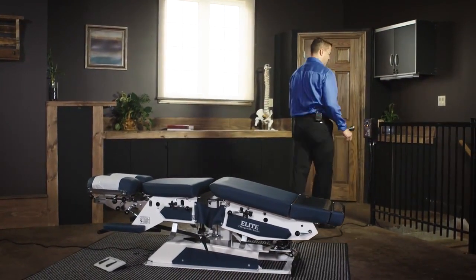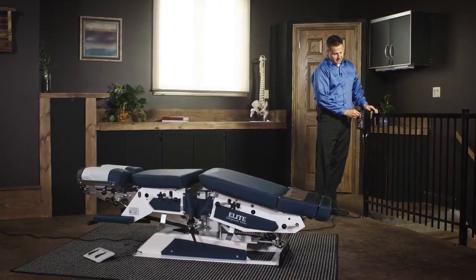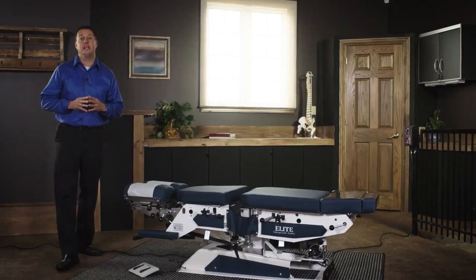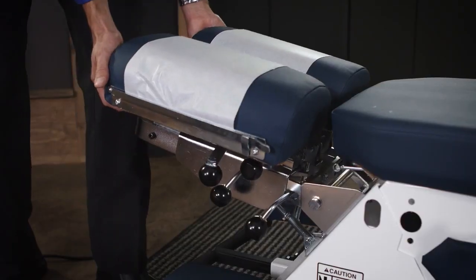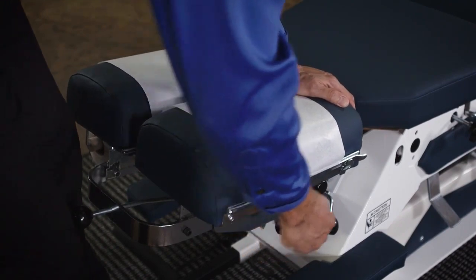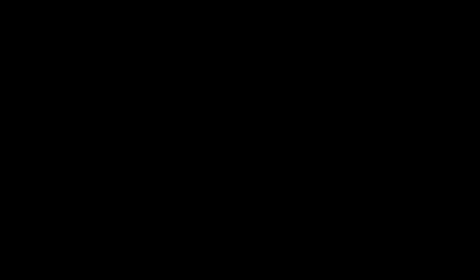In order to turn the table off, we bring it back into its neutral position and turn it off. All Elite tables come with a multi-directional headpiece, which will tilt, elevate, spread, and drop. This is the Elite Auto Flexion Table.